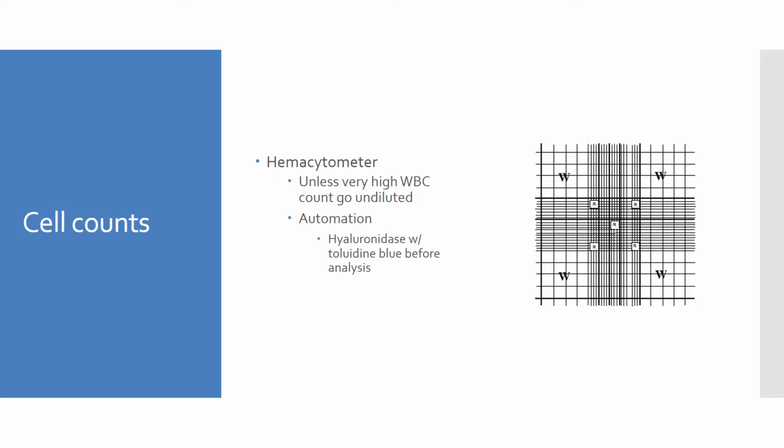Now, synovial fluids can be counted on the automated machine. That is possible. That'll be up to the procedures in your hospital. However, synovial fluids can be quite viscous, and so that viscosity does frequently lead us back to the hemocytometer. Okay, probably the most common fluid counted there will be your synovial fluid. Okay, the hemocytometer is still the gold standard, and if you do have a very viscous specimen, you've got to get the hemocytometer out. You put that in your machine, and it clots in your machine. Everybody's going to be annoyed at you.